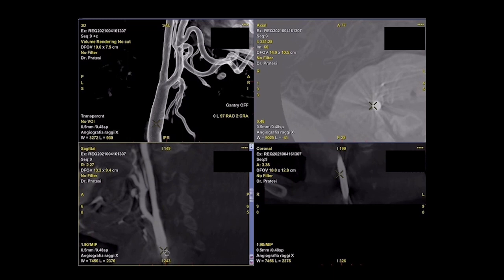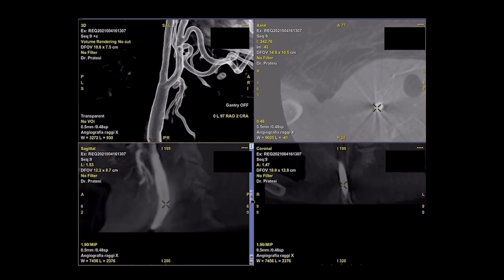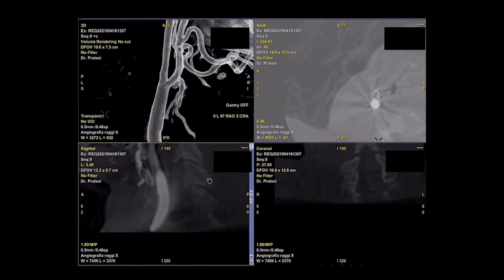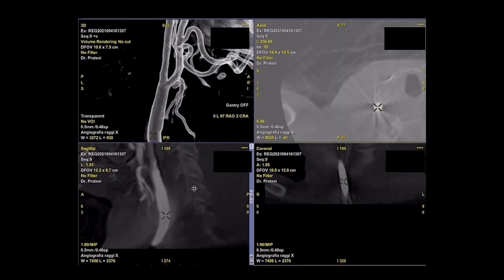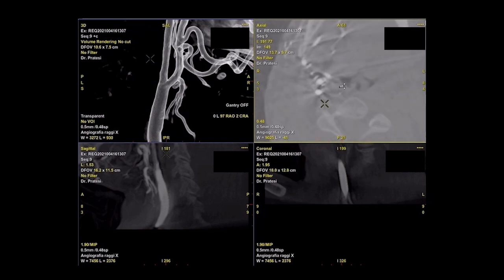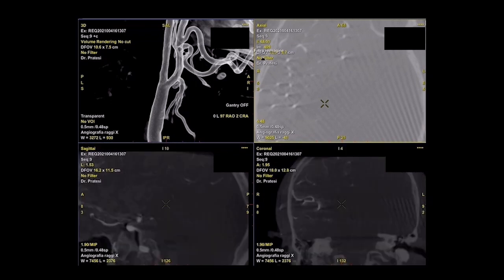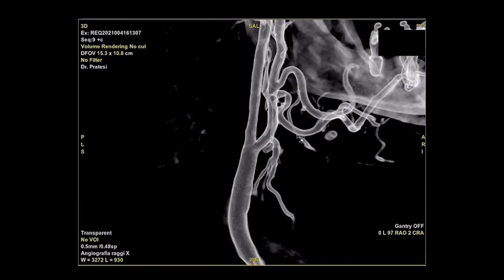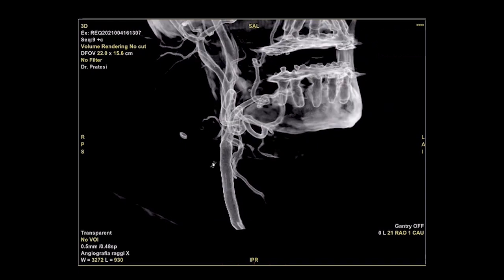This is particularly useful in the aortic segment, as we have already seen, but also in this kind of procedure, where you can perfectly analyze the wall position of the stent at the level of the carotid plaque, as well as all the intracranial circulation. The wide bore with this particular GE system, due to the distance between detector and source, allows us to cover a large field. This is particularly important when we perform abdominal 3D combined CT scan, but also when we use this kind of feature at the level of the neck itself.